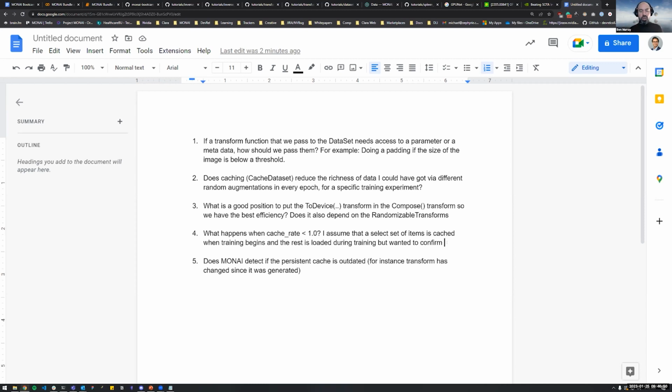I'll answer it assuming you mean that there isn't enough budget for the cache: a subset of your data will be cached. Just like with a cache, you'll get some of the benefit if your cache access pattern is helpful to you, and given that the dataset ordering is typically randomized, it just means some portion of your dataset will not need to be unnecessarily processed and some portion will.